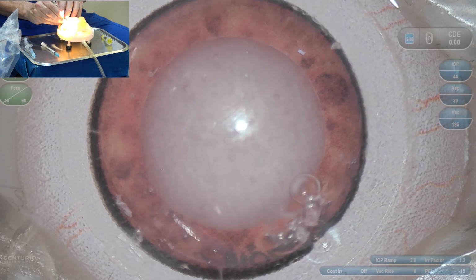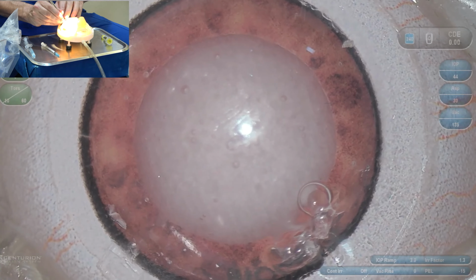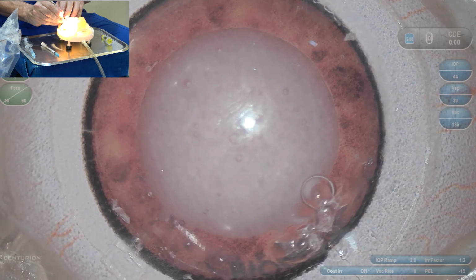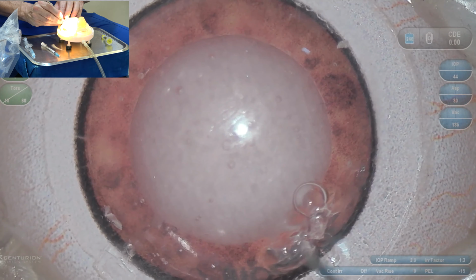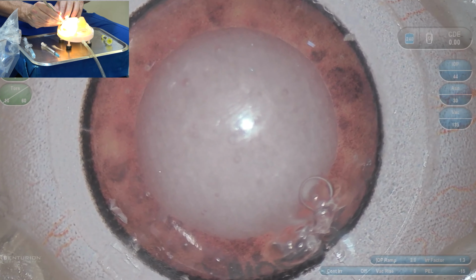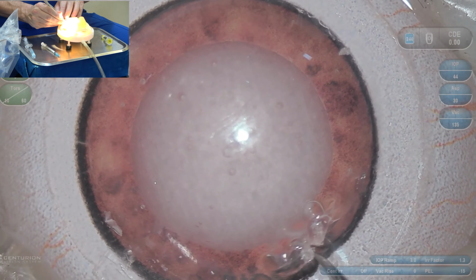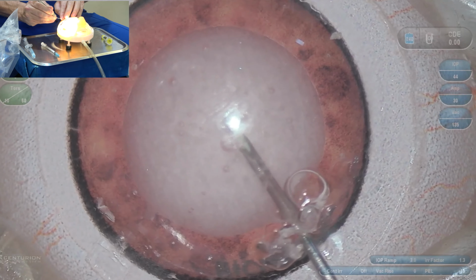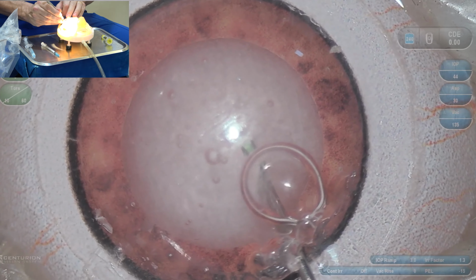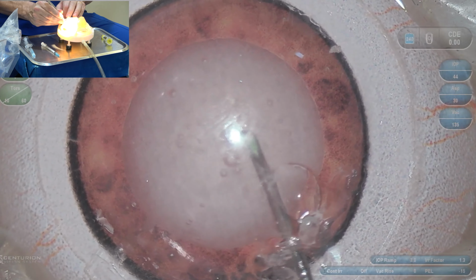Okay, let's try to do it very nice, very round. This is a rhexis that behaves very, very hard. As you can see, the capsular rhexis looks very nice. Perfect. We're going to remove this, and we're going to do a little bit of hydrodissection, very, very small.